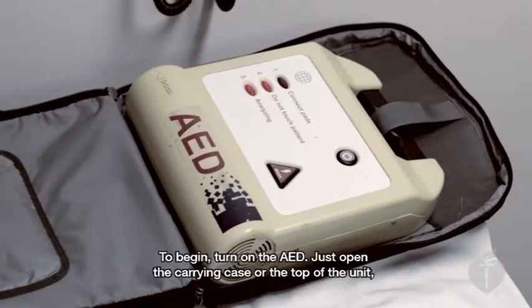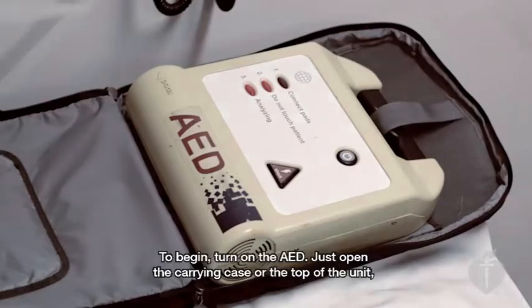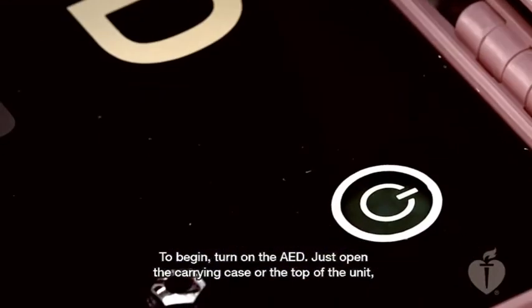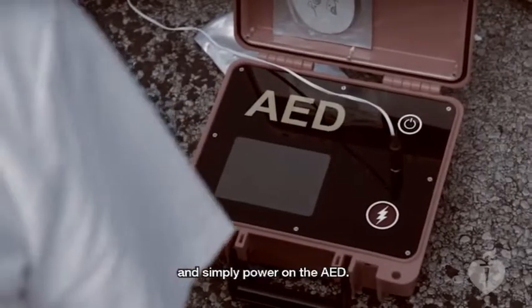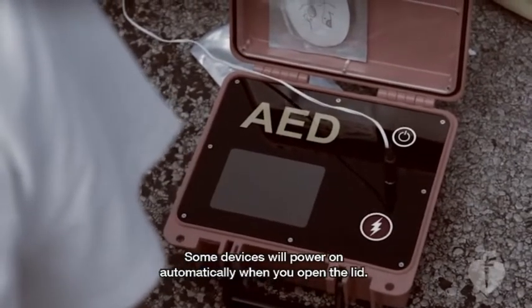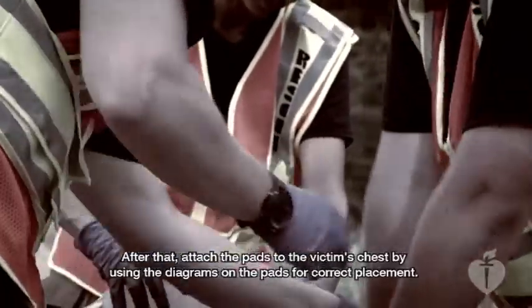To begin, turn on the AED. Just open the carrying case or the top of the unit and simply power on the AED. Some devices will power on automatically when you open the lid.